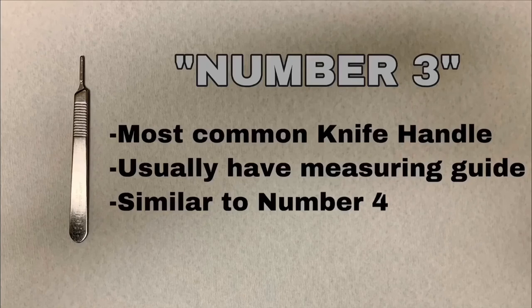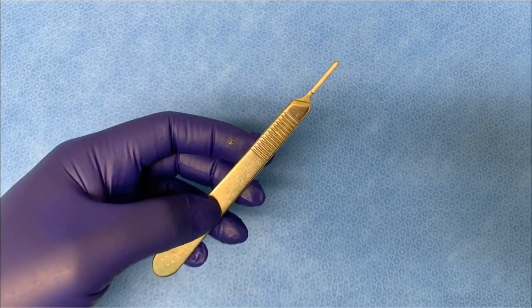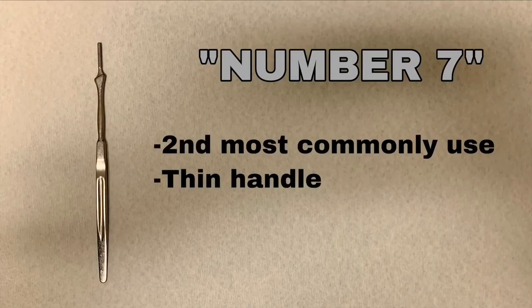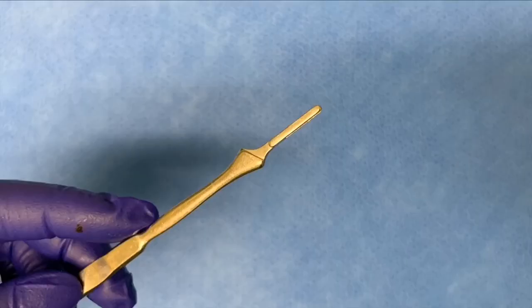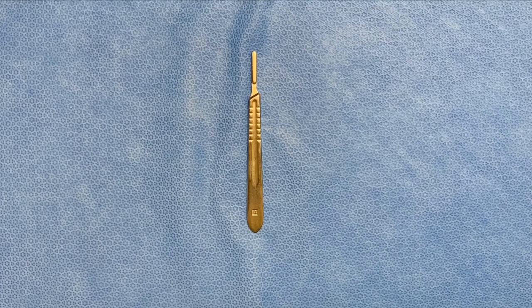This is knife handle number three, the most common knife handle. It usually has a measuring guide and is similar to knife handle number four. This is knife handle number seven, the second most commonly used knife handle — it has a thinner but longer handle. This is knife handle number four; it is rarely used and similar to knife handle number three.